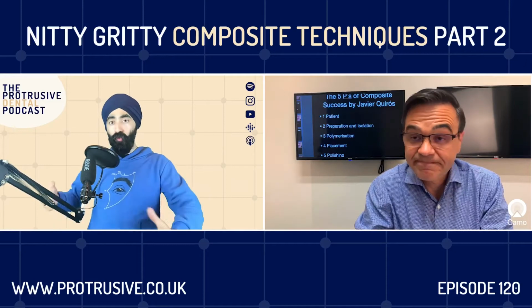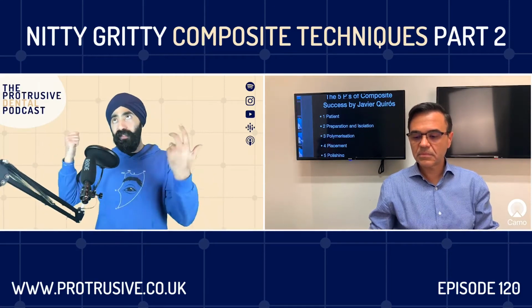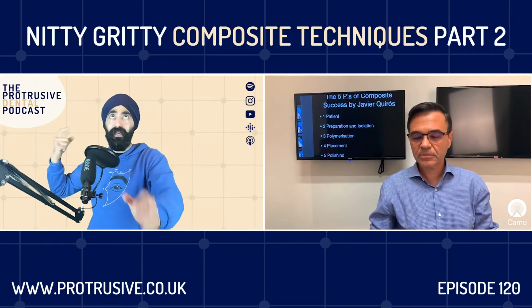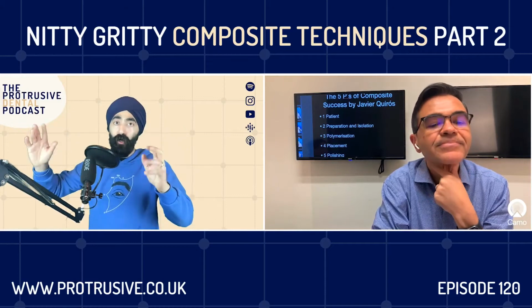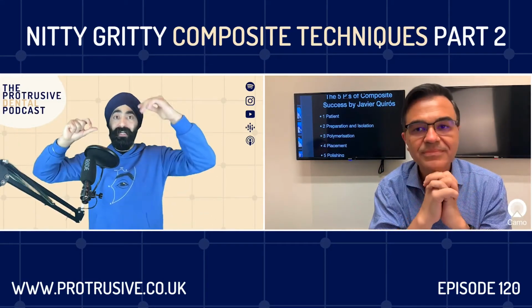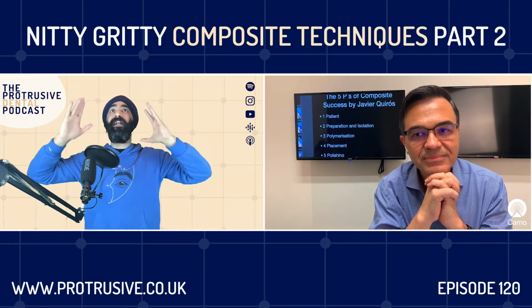Now, before I ask you where we can learn more from you and how we can reach out to you, I just want to touch on one thing which piqued my interest. You said with the digital, you're doing the digital Facebow transfer. Please tell me about that, because the way I do a lot of my digital dentistry is I record my bite at the desired OVD in the arc of centric relation, and then I rely a lot on the photos, and I tell my technician, okay, lengthen this tooth by 1 millimeter, lengthen this tooth by 1.5 millimeter, based on the facial photos and the side photos.